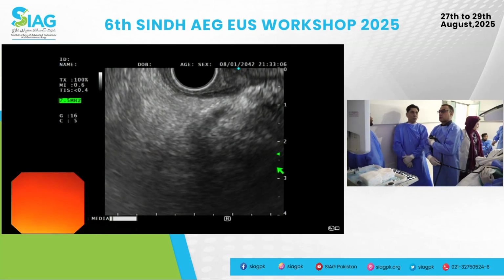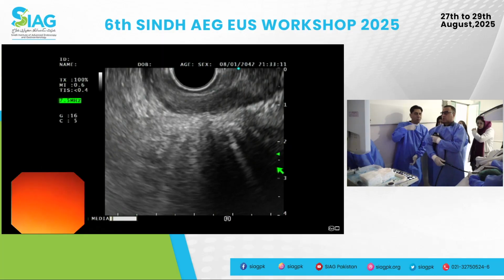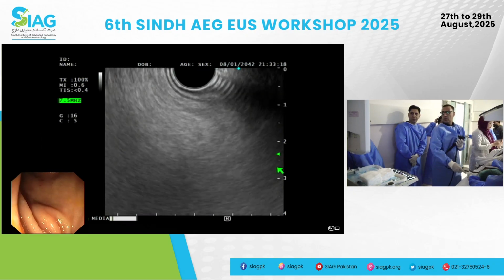Nadeem, we are with you. Okay, excellent. So thank you very much. Let's present the case. Do you want to go back to D1 and demonstrate the pathology? Am I audible? Can you hear a bit in the room? Can you?